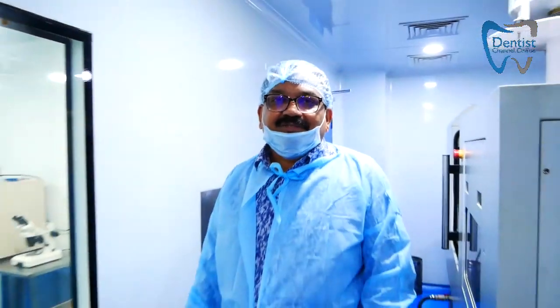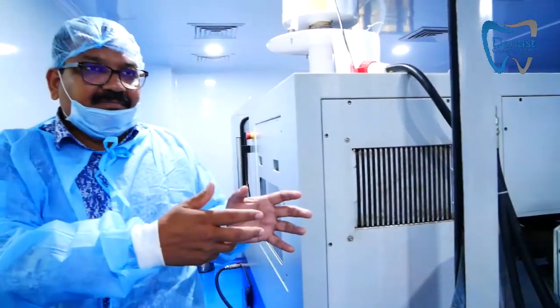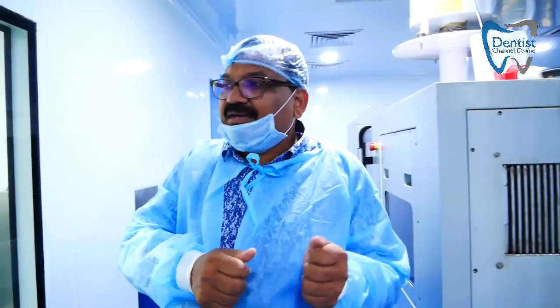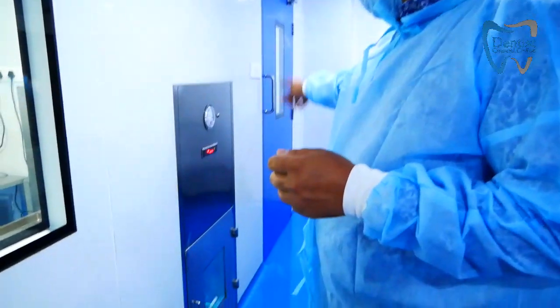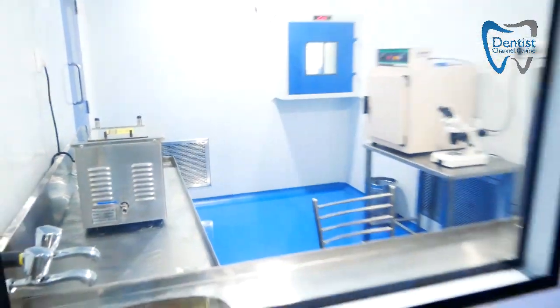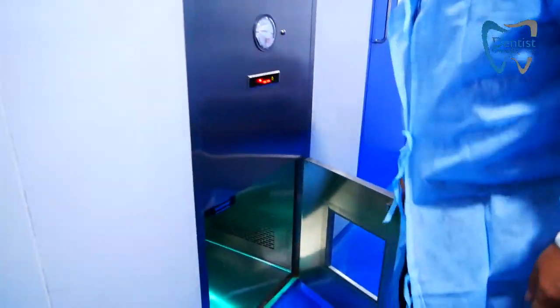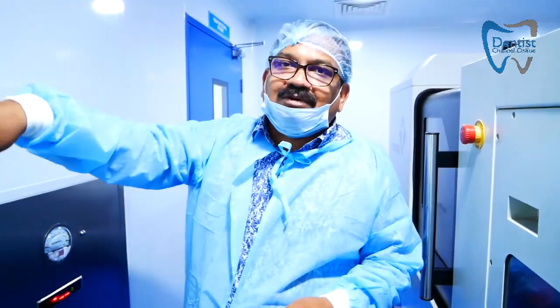Once the implant is produced, it is contaminated with machining oil, so the first challenge is to remove the oil completely from the surface. For that purpose, we have a production machine and we use small pass boxes to transfer implants into the clean room. The pass box maintains clean air so that the clean room is not contaminated.